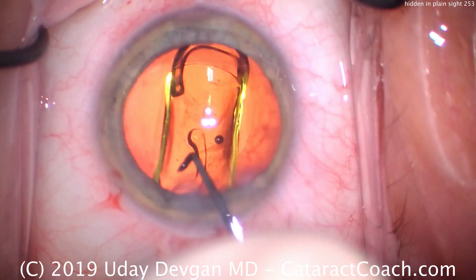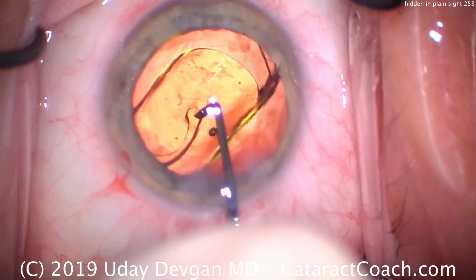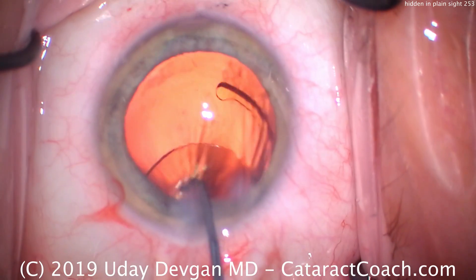But there is a complication that's present even now — a potential complication that would require a return trip to the operating room. We don't want to do that. Watch carefully, let's see what that is.